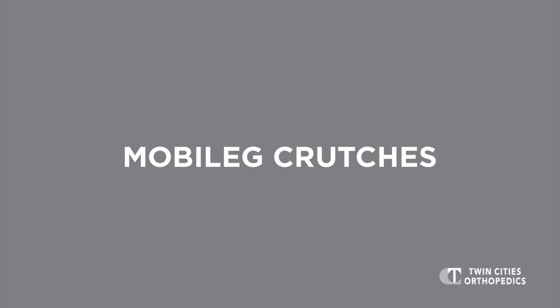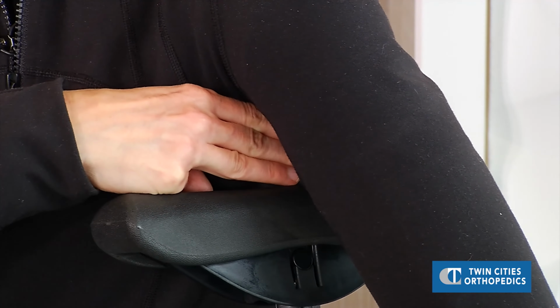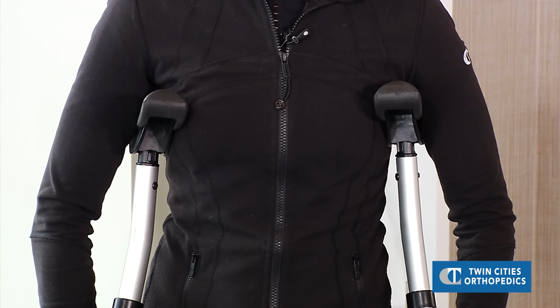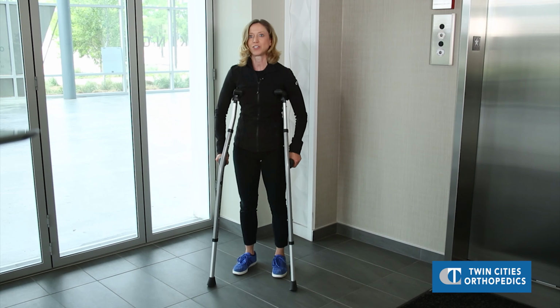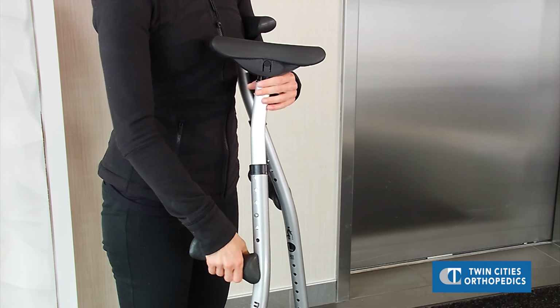For the Mobileg style crutches, stand with upright posture with the correct crutches in each hand, labeled left and right. Place the saddle under your arm 2 to 3 fingers from your armpit, then adjust the top portion of the crutch so that your elbow is slightly bent on the grips. Next, adjust the bottom portion of the crutch so that the rocker bottom is 6 inches in front of your toes. With these crutches, you have to adjust the top and the bottom of them.